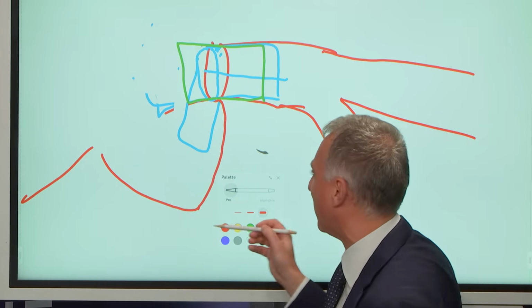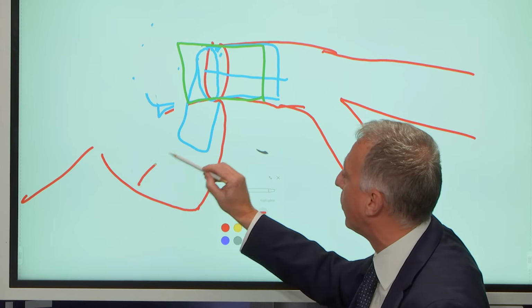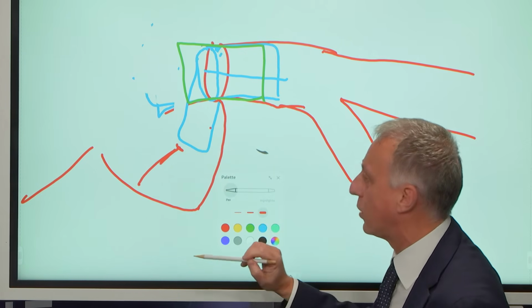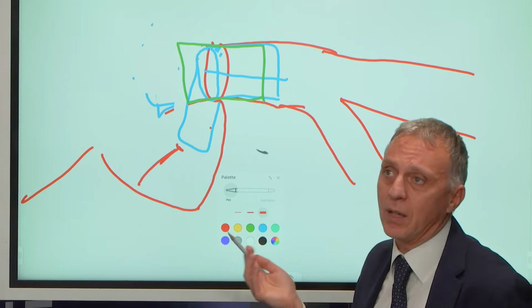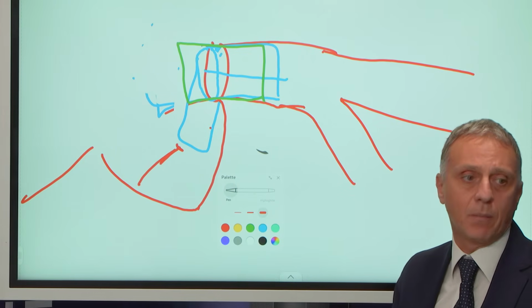Let's say in all the patients, we have aortic valve. So the main concern is regarding the possible damage of the leaflets of the aortic valve with the crushed stent. So this is the explanation why this is not the recommended technique all the time. It should just be regarded as a bailout strategy.